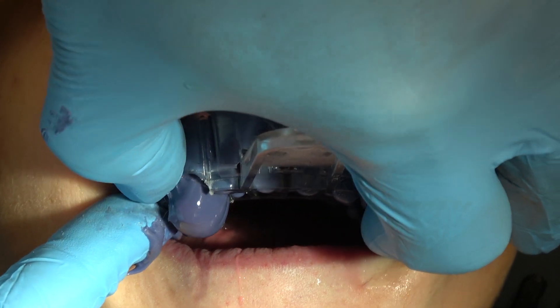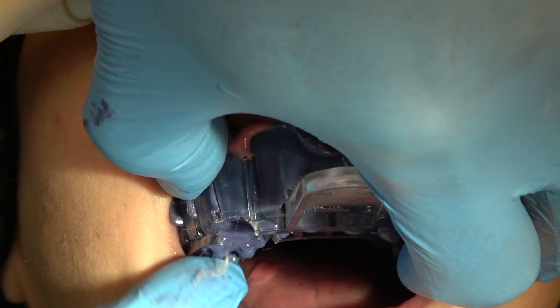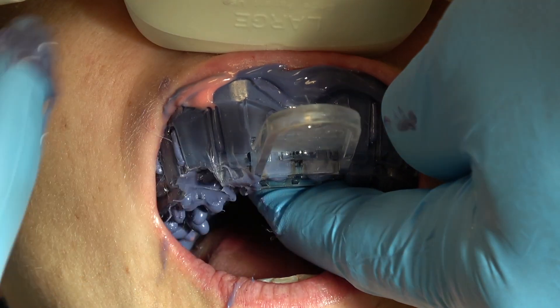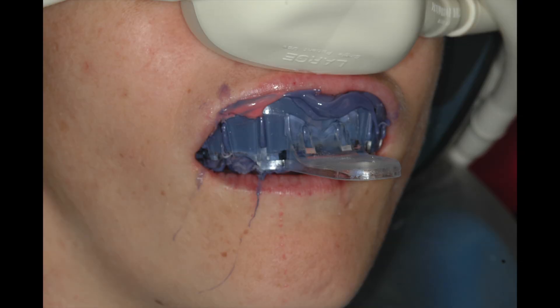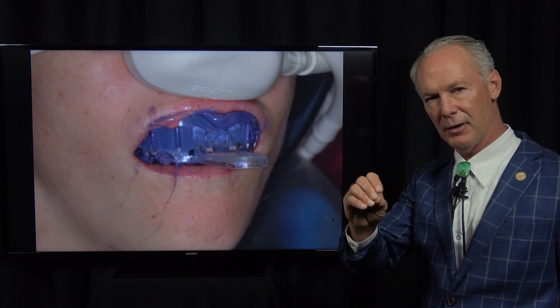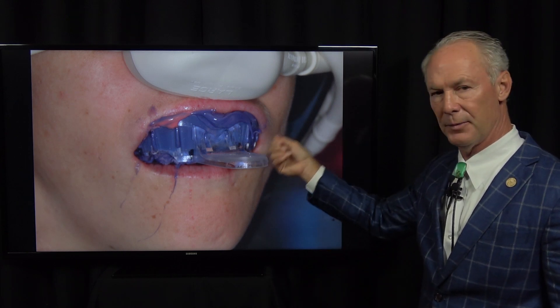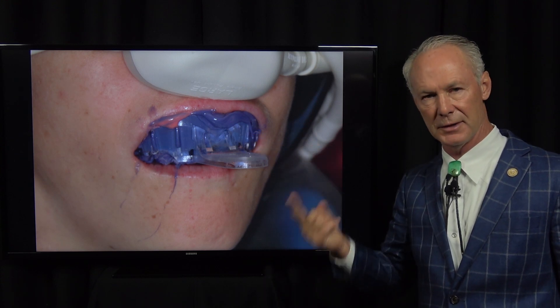Now I'm going to place my finger — I'm going to wipe this material away from the impression coping and put my finger on top of the coronal part of the impression coping. If you just wipe it away and don't put your finger back on top, that material will ooze over the top of the impression coping and you'll have to tear away the impression material to get to the coping to unscrew it. So leave your finger on there while the impression is setting up.